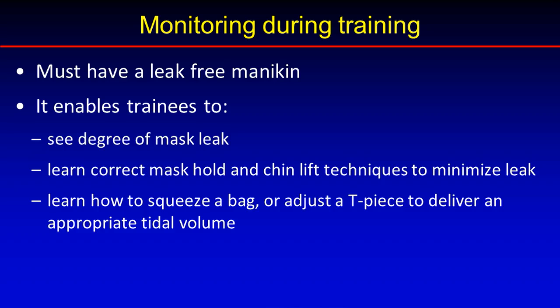Once they've minimized the leak, which can be done easily once you can see what's happening to the volume of gas in the leak, then the next thing is to be sure that you're squeezing the bag properly or adjusting the pressure on a T-piece device. Now, most people squeeze the bag too hard, and squeezing a resuscitation bag should only need 1 or 2 fingers. You're trying to get in a tidal volume of roughly 5 mils per kilo. So even for a term baby, that's only 15 mils. And adjusting the pressure might seem easy, but it's surprising how people can't think about adjusting the pressure to get the tidal volume. And the monitor then shows you what's happening and how well you're succeeding or not.